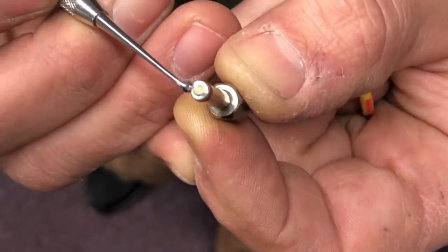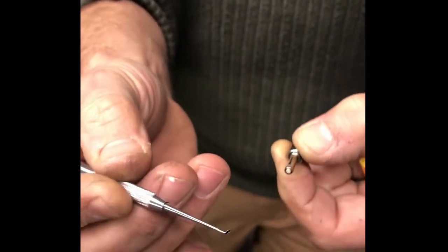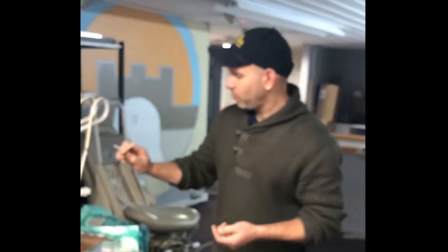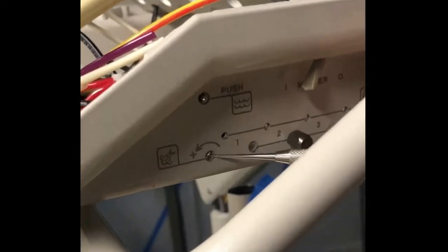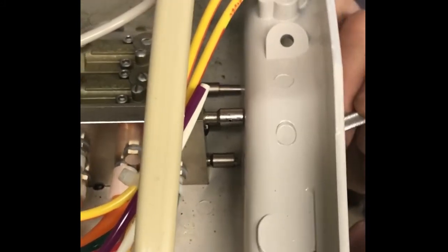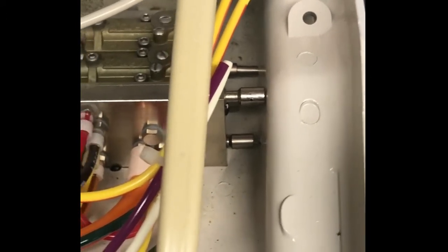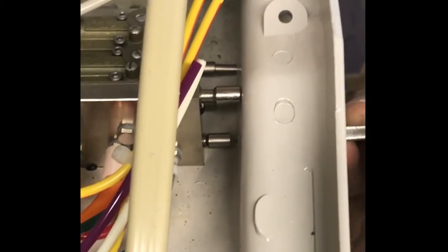Now there's an O-ring, so the first thing we're going to need to do is get the O-ring off of the other side. So I'm going to use just this little bit of a dental device, and I'm going to dig it out. We just got this inserted in there, and you can watch me work from the top angle. You'll be able to see in there. I can see where it's at, and I'm just going to fish around until I can successfully remove the O-ring there.